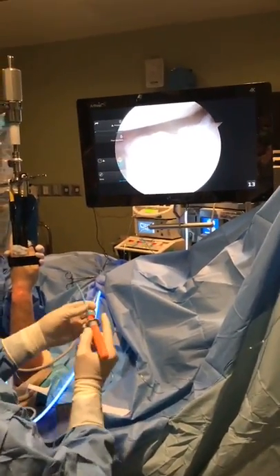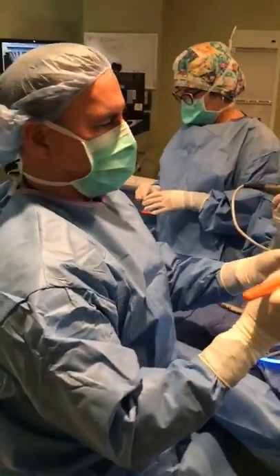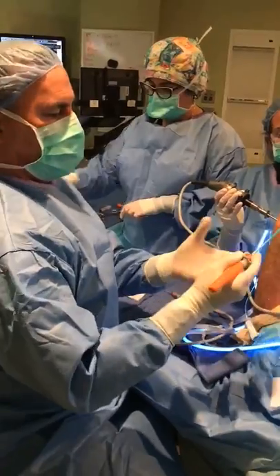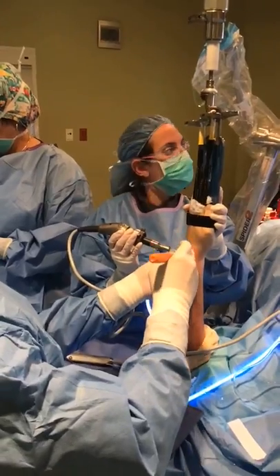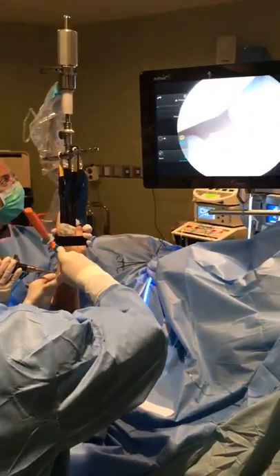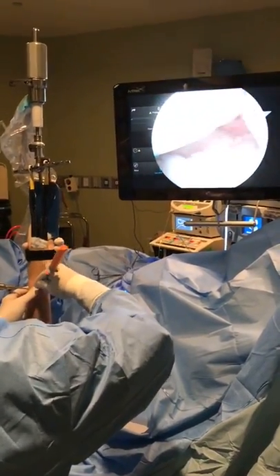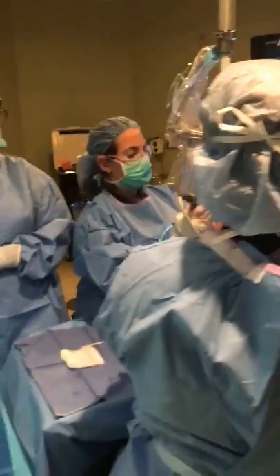Okay. All right, so this is a device that is very similar to the repair that my colleague, for example, Dr. Herrera, our knee guy at the Ortho Now Centers in Miami, to whom we refer a lot of the knee problems, would use to repair the meniscus in the knee. This is obviously a smaller one for the wrist, but the same principle. Okay, so I'm going to go in. Now I'm in, so now I take the protective sleeve off because you see it's very sharp.